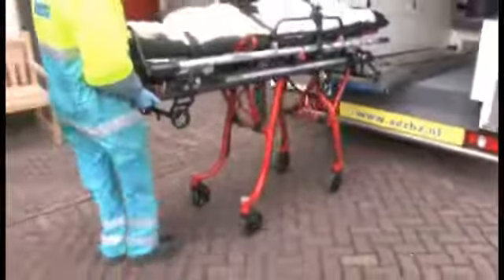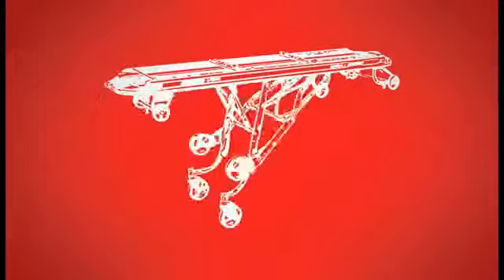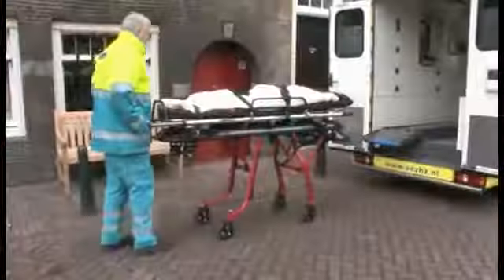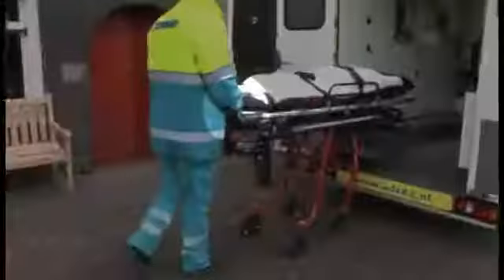To unload the cot, disengage the fastener and pull the cot out of the ambulance in a smooth, continuous motion until the cot is fully removed. The ratchet mechanism will automatically lock the legs into position. Confirm the legs are locked before moving the cot. When loading or unloading the cot, you may pull or push using the extending lift handles on the stretcher, the transport lift bars, or the stretcher footrest.